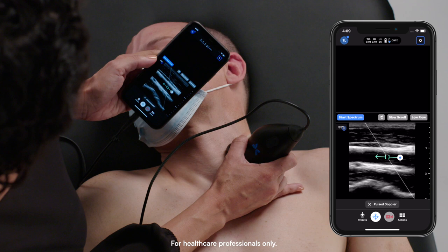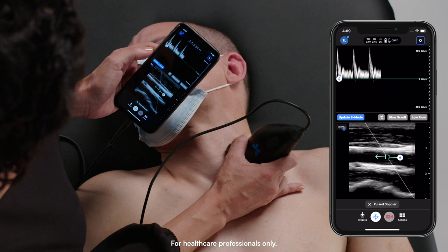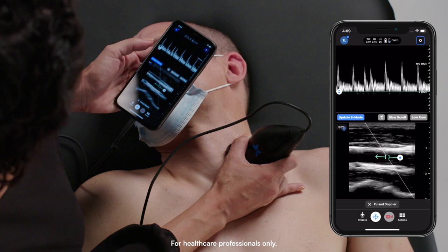To begin tracing, I'll tap on start spectrum and if I wanted to adjust the baseline I can slide the baseline up or down for the desired setting.